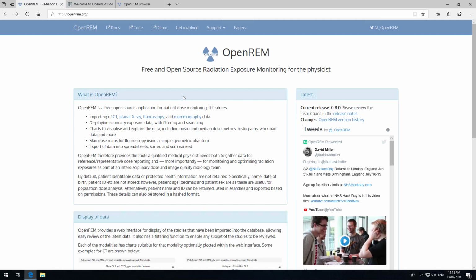In this multi-part tutorial, we show you how to install OpenREM for use within a medical institution. The intended audience are medical physicists, but this tutorial will be useful for anyone wanting to understand what's involved to set up such a system.